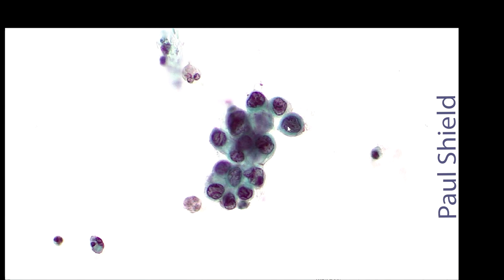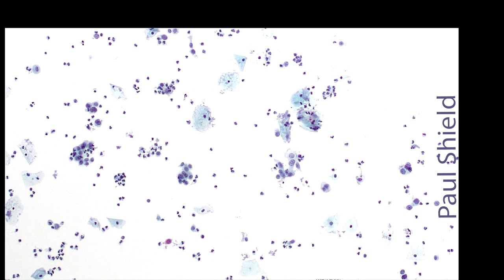See that one there still has really squamous cytoplasm. I can see the border of the cell quite well, and it's not columnar, it's a round cell with a nucleus centrally placed. But notice there's variation in nuclear size and shape, hyperchromasia, and quite a high NC ratio. This case has quite a lot of them lying around. See, they're quite small, in little loose groups in this case.